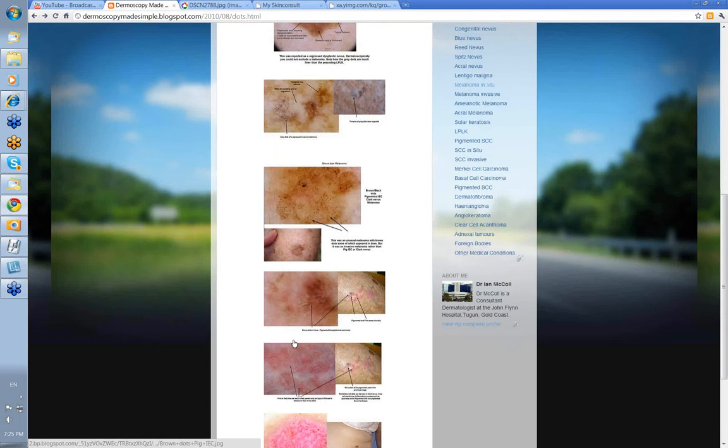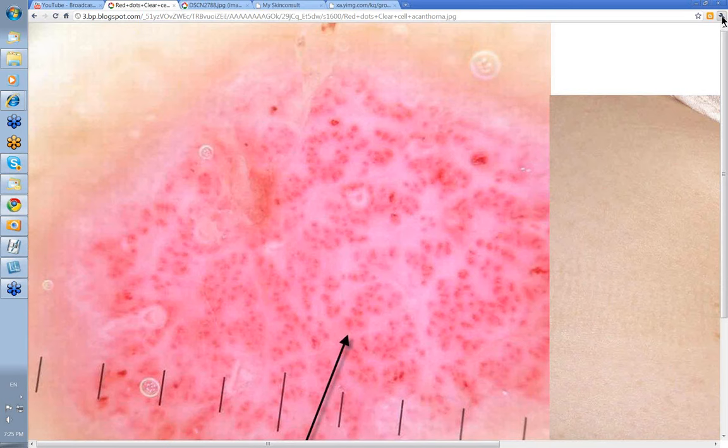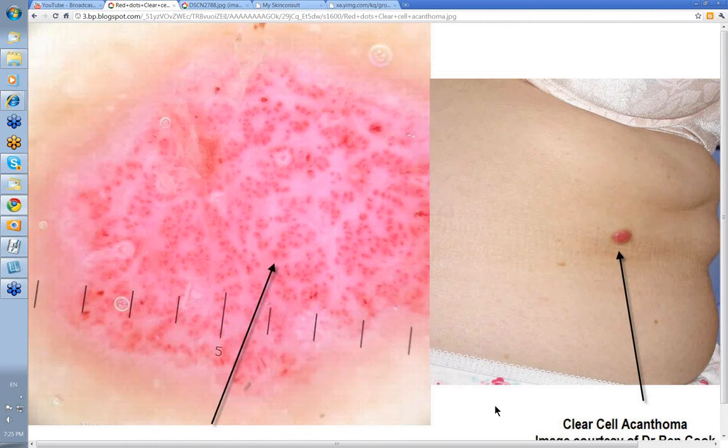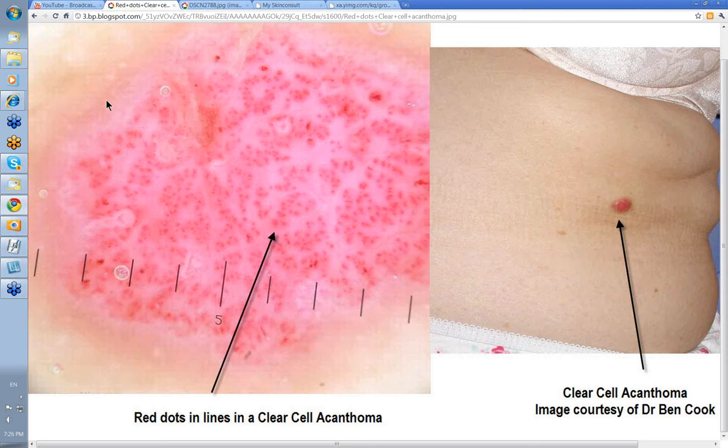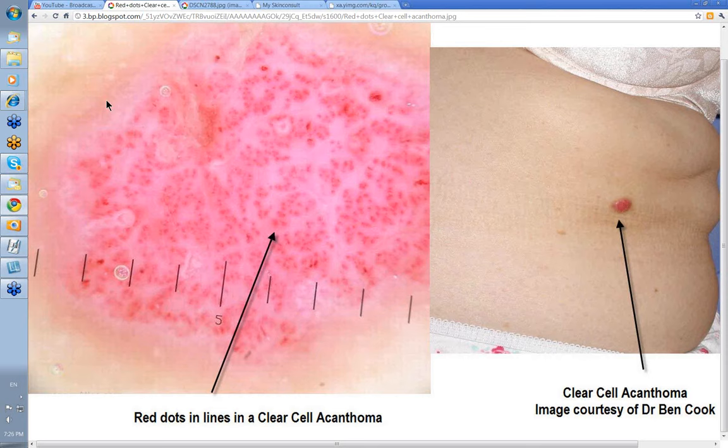Let's look at some really nice red dots — an absolutely classic example. Look at these red dots, and how they are almost in lines. They are sometimes colloquially called strings of pearls. This is in fact a clear cell acanthoma. Apologies for the phone in the background. So dots are important — thank you very much.